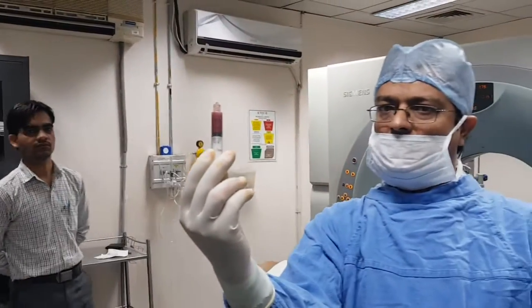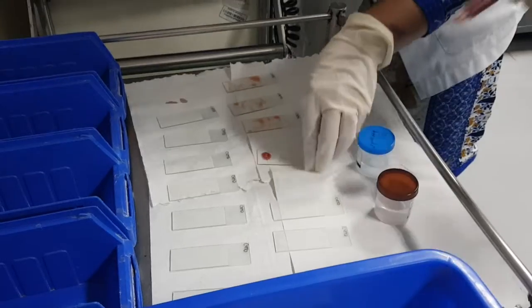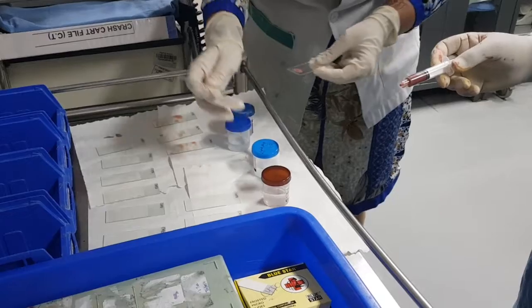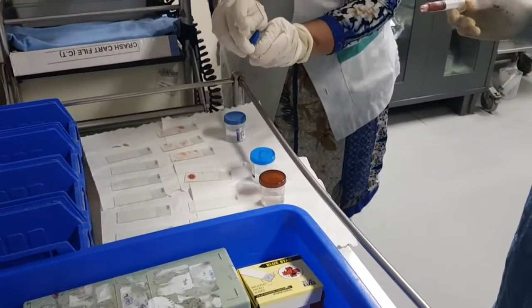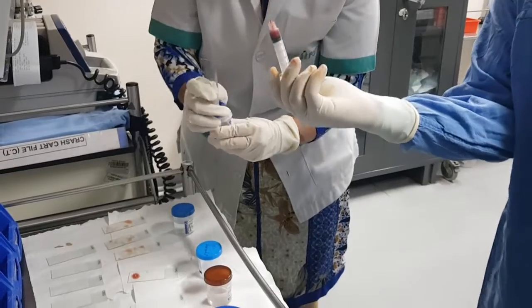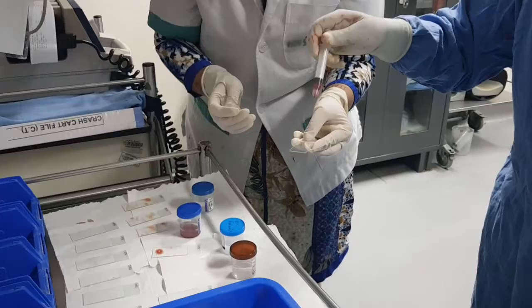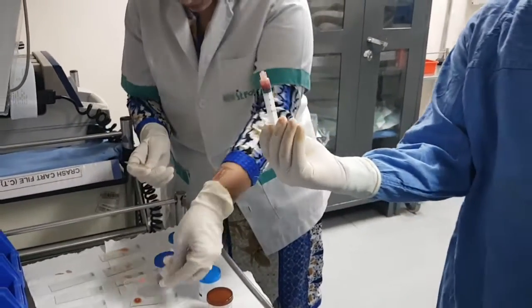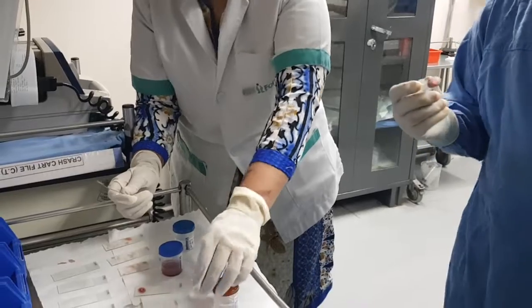We put it here — this is how it is. Take it in the culture sensitivity bottle. We are taking some material in saline. This material we would like to send for gene expert. We've taken some slides — not formalin — solid material.